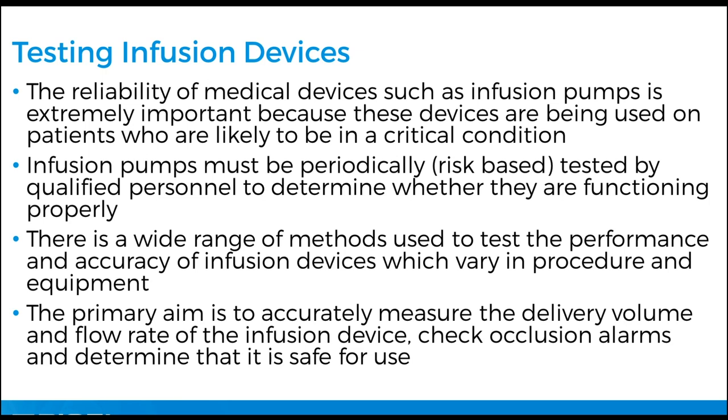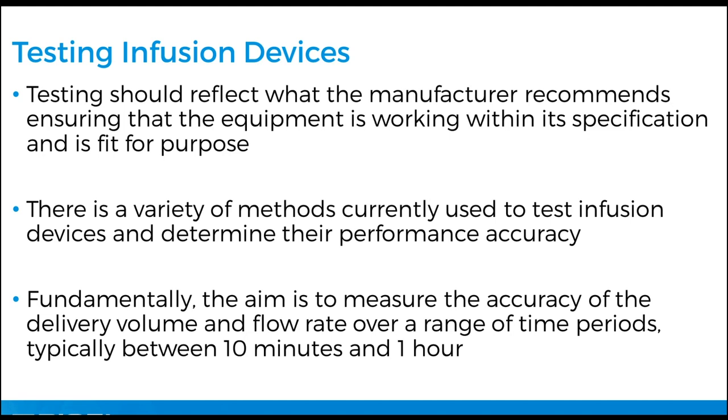However, there are some simplistic nice-to-have features with using something like the Rigel MultiFlow. But the primary aim really is accuracy, or accurately measuring the delivery of volume and flow rate of the infusion device, checking the occlusion alarms and determining how safe these things are to use. Testing should reflect what the manufacturer recommends. Always, the manufacturer has a specification.